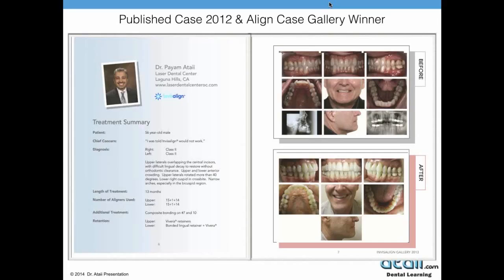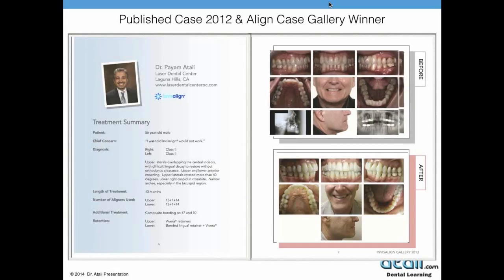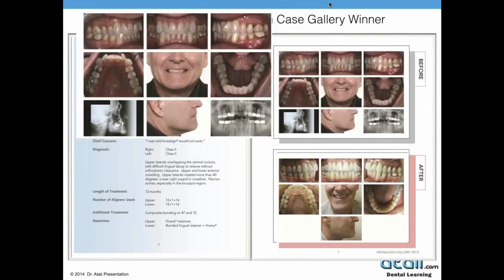Now, in my particular case, going back in the history of Invisalign galleries, I've played with class 1, class 2s, and even class 3. We've done some surgical cases, and some patients would come to our office asking, how long is my treatment time, or can this be done with Invisalign? In this particular case, another published case, his concern was not only the lateral, but can we actually get his narrow arch widened? And with the movement of the sleep apnea and some of these occlusion movements that have always been there, you start to recognize, how do I get these teeth moved to predictable spots?